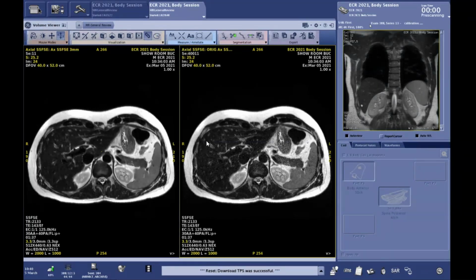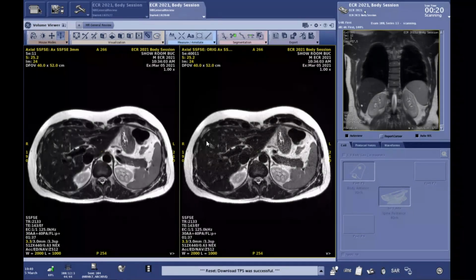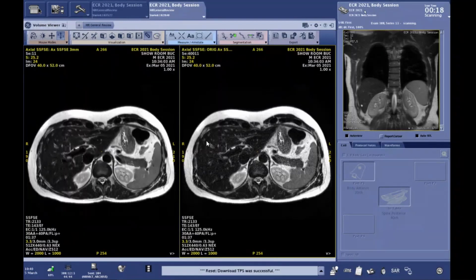I will show you the pasted image between the two steps, and it will really give you a taste of what the AIR coil can bring you in your clinical daily routine. It's really linked to the AirTouch interface, where we don't need to deal with any coil selection, and you will not have to move the coil during any examination.